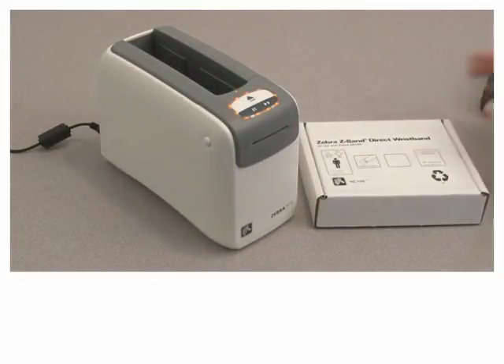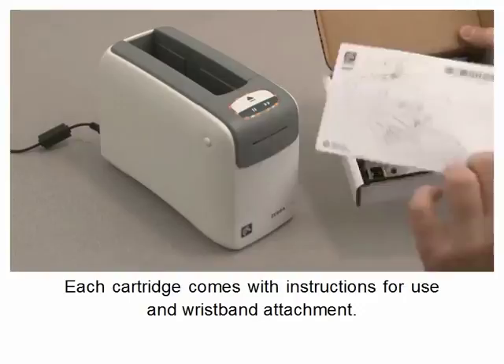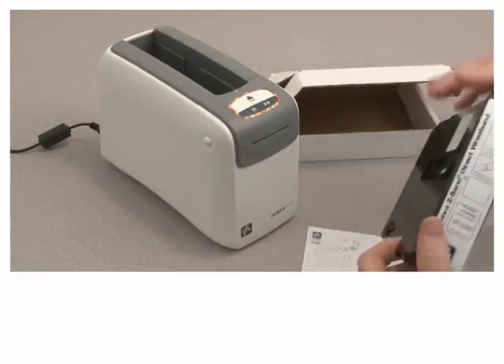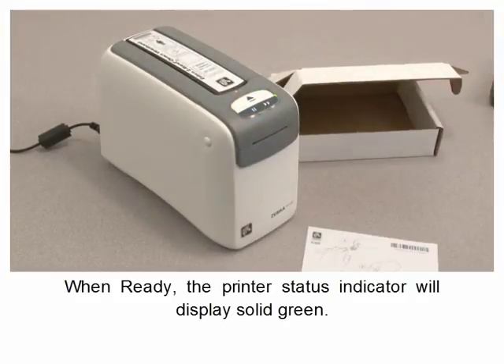Remove the new cartridge from its packaging. Each cartridge comes with instructions for use and wristband attachment. Insert as shown and press down when ready. The printer status indicator will display solid green.